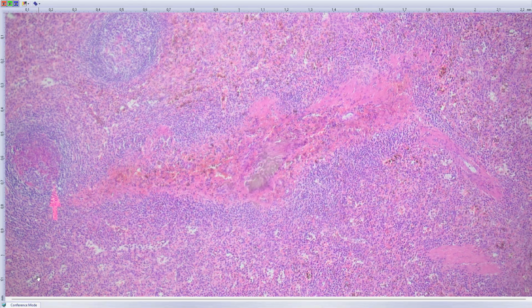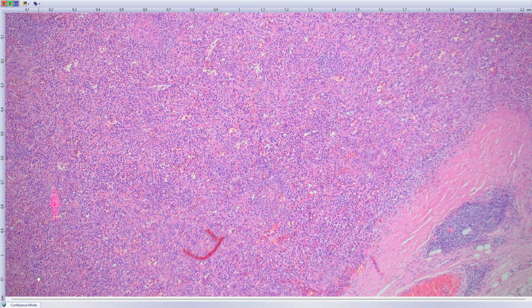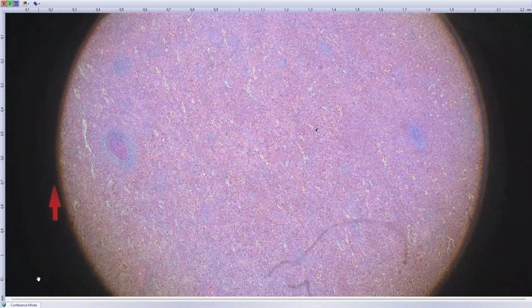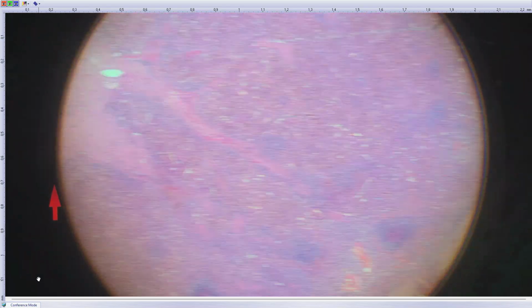It's a tumor of... yeah, it's a nice case. I got it as a strange muscular hemangioma or hemangioma of lymph node. There were several nodules under the curvature of the stomach.